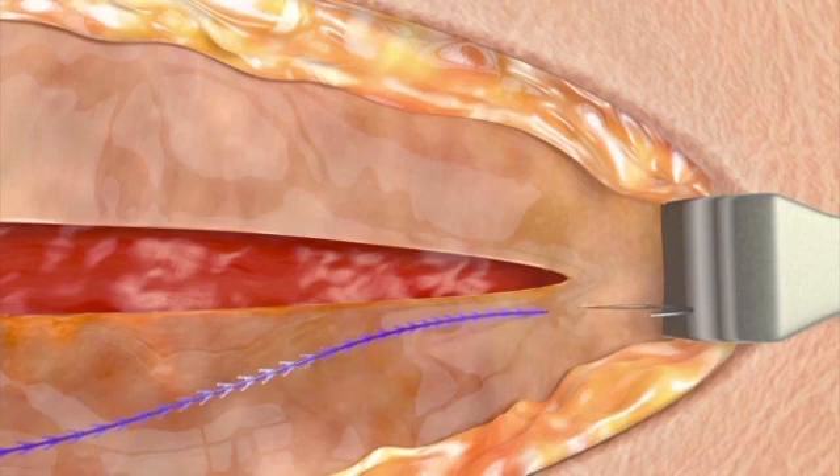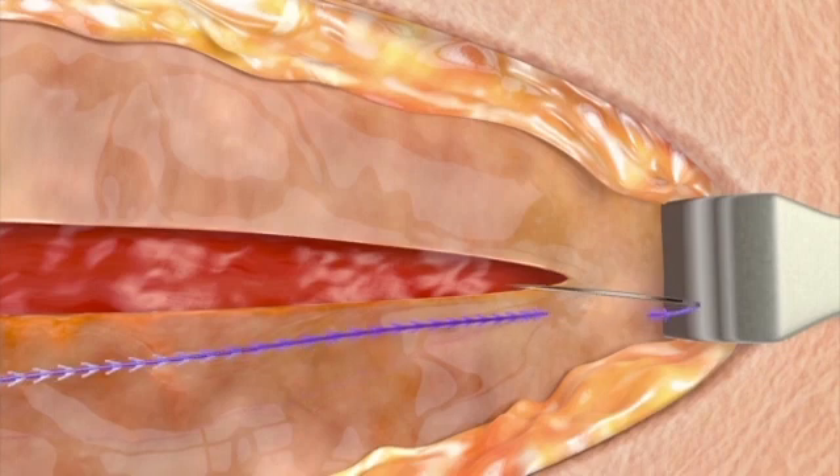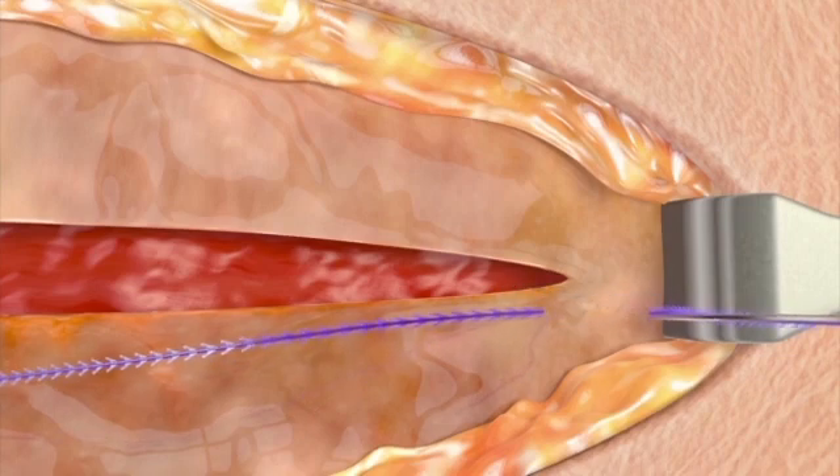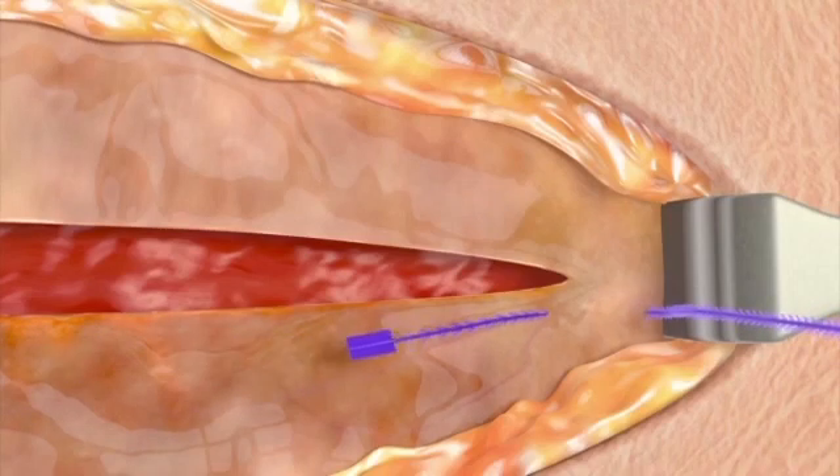Make sure to leave enough space past the apex to place a locking stitch in intact tissue. Pull the device through the tissue to gently seat the fixation tab. The fixation tab should be seated above the intact tissue and be visible. Do not exert additional force on the fixation tab or device.